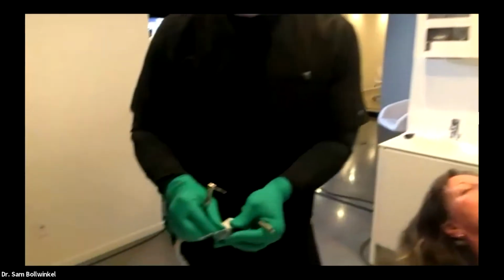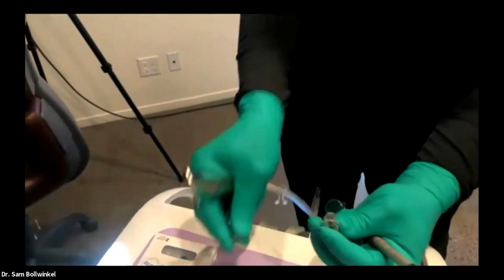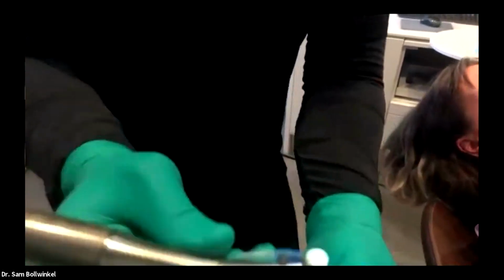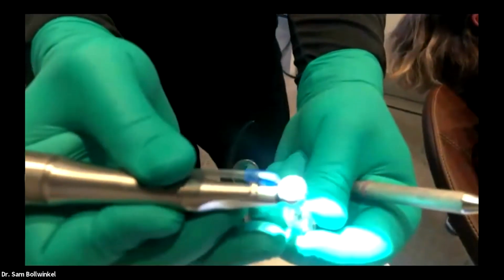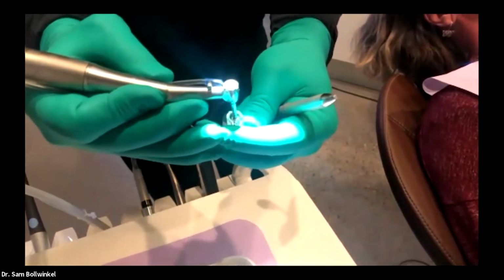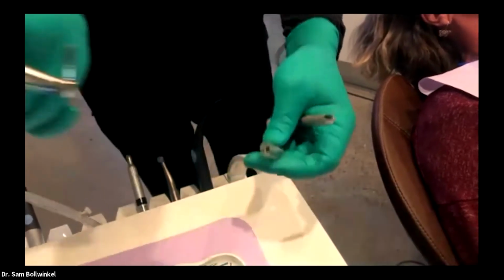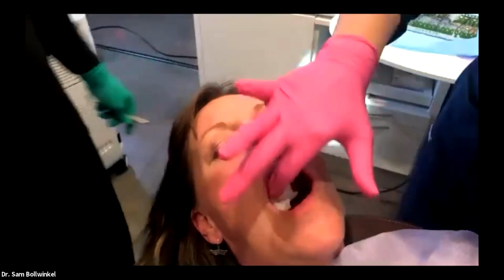So as we take out the implant here, we've got our driver now in place. We've switched our motor over to implant. We've set the torque value. We come in there and pick up that implant. There we go. Make sure that stays there on my implant. Little friction fit piece. Good. All right. Implant is in place. Go ahead and throat pack for me, please. A little throat pack, and we're going to go to implant placement.